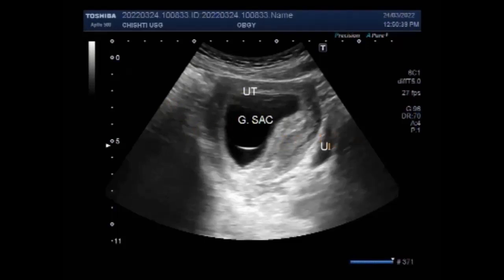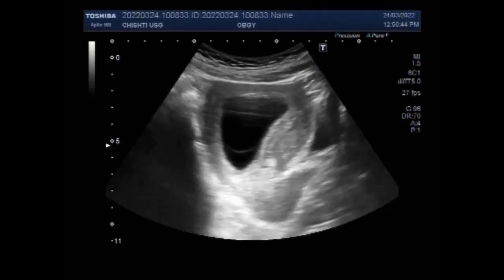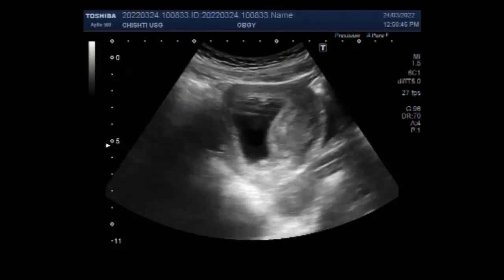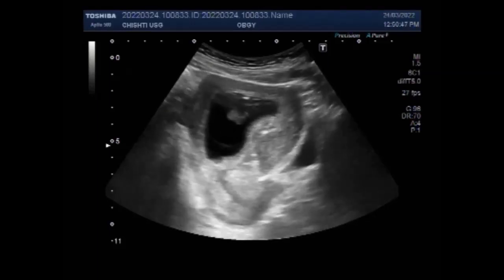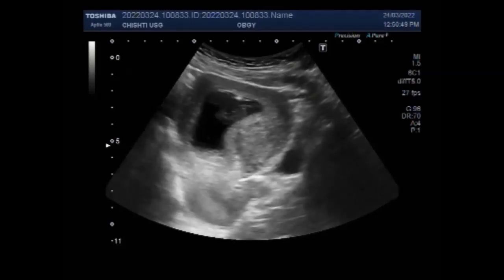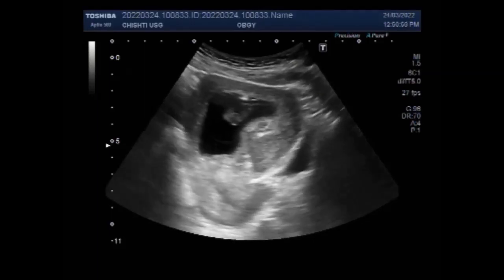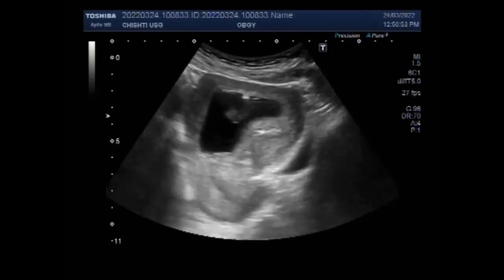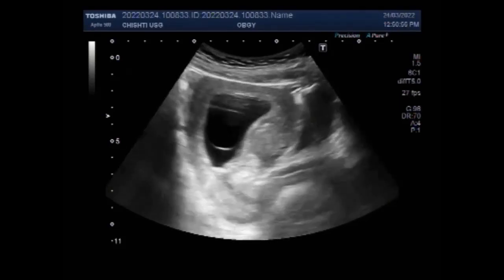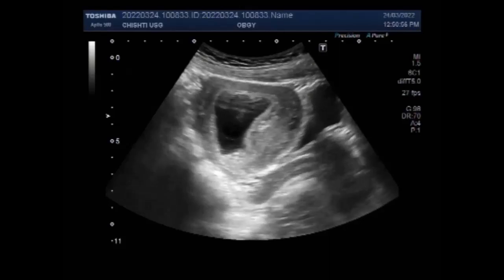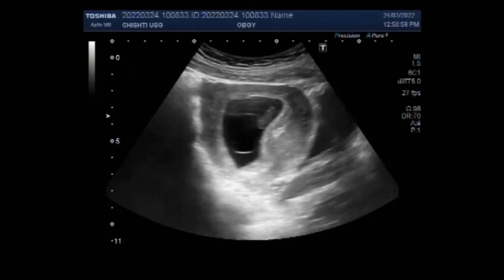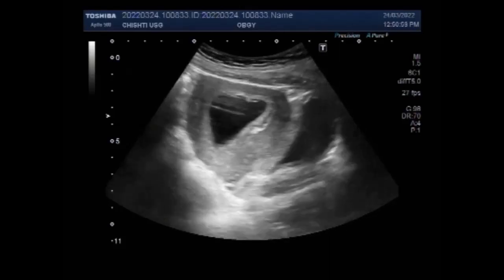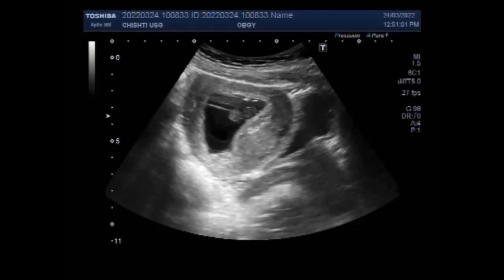Ultrasound diagnosis of miscarriage should be considered when either a mean gestation sac diameter is equal to or more than 25 millimeters with no obvious yolk sac or fetal pole, or a crown rump length of equal to or more than seven millimeters without evidence of fetal cardiac activity.